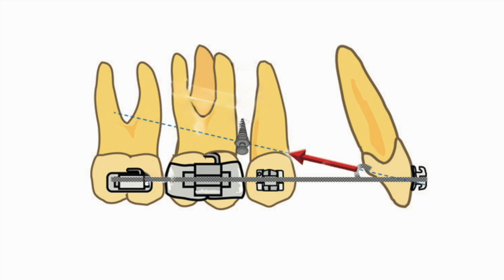Because the wire has play within the bracket slots, the connection between the anterior and posterior segments is loose. In this scenario, the active unit is divided. The anterior segment reacts first, and its movement subsequently affects the posterior segment, so they are two separate active units.